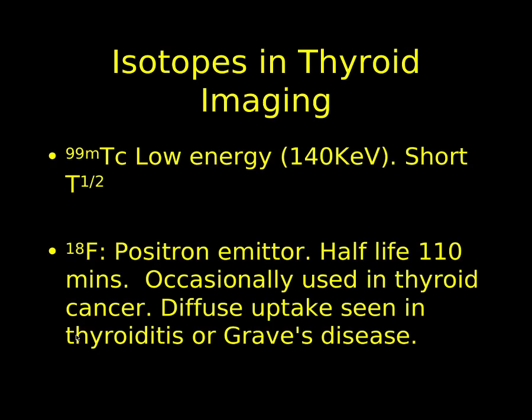I'm just going to also mention that that's only for fluorodeoxyglucose. The amino acid tracers like F18 choline are taken up in organs which are producing quite a bit of protein, and so you'll normally get diffuse uptake in the thyroid gland.